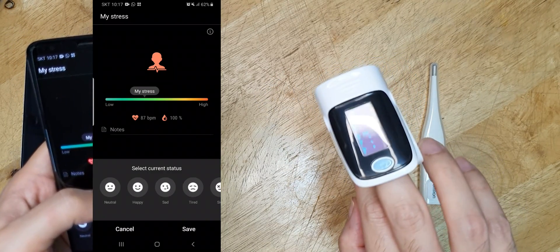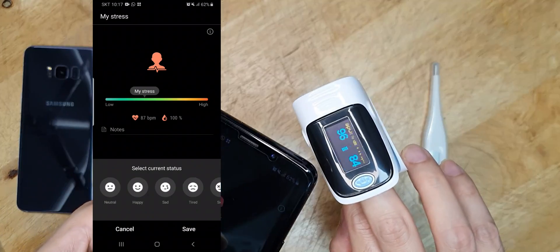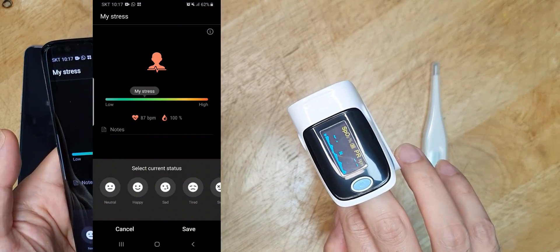Now let's check the actual oximeter reading. It says 96% SpO2 and 84 bpm. The heart rate BPM is quite accurate, but the SpO2 levels may not be accurate.